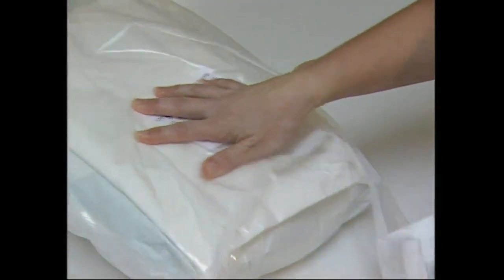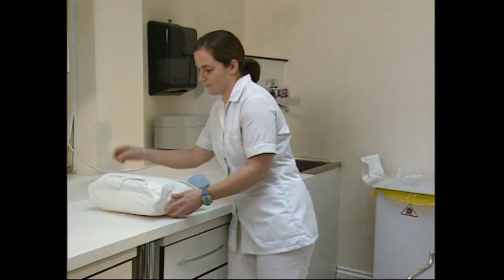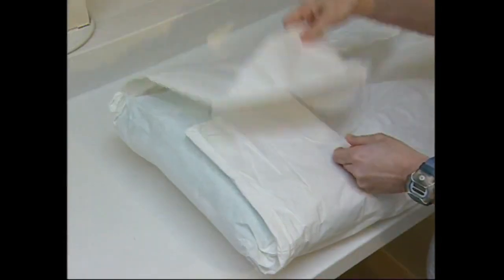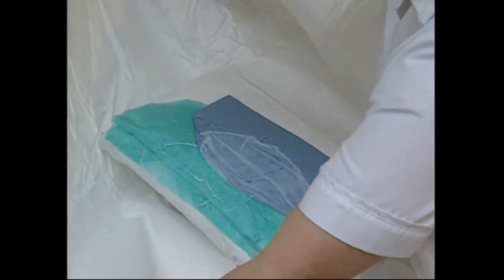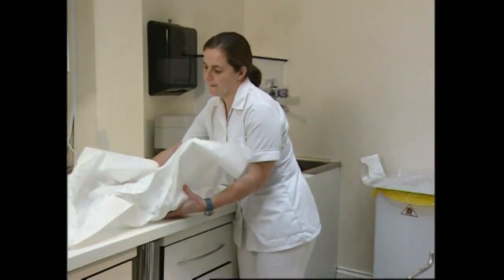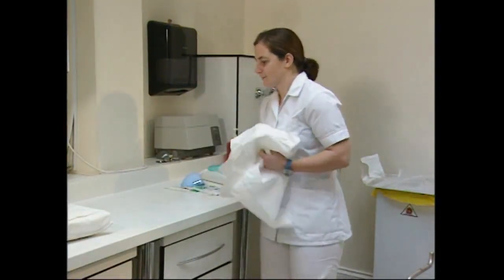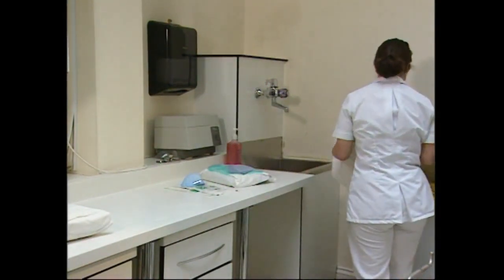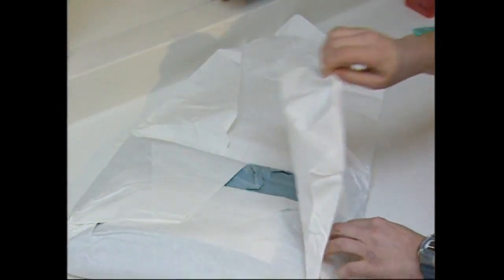The sealed plastic cover of the drapes pack is removed. The outer wrapping of the drapes pack is opened and the pack containing the gowns is carefully separated and placed to one side on the work surface. The pack containing the drapes is separated from the outer wrapping and placed on the work surface closer to the patient. Please note the way that the assistant holds the drapes pack so that she does not contaminate the wrapping. This will ensure that she will not contaminate her gloves when she opens this pack after gowning and gloving.